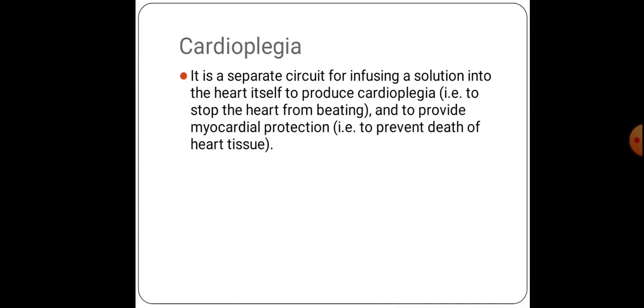Now let us look at the term cardioplegia. It is a separate circuit for infusing a solution into the heart itself to produce the cardioplegia, that is, to stop the heart from beating. We are just ceasing the heart function, and providing myocardial protection.